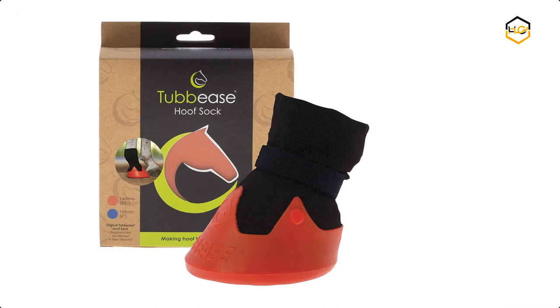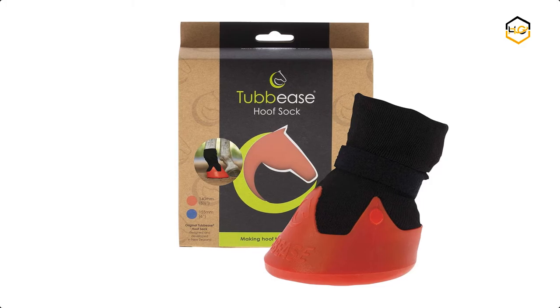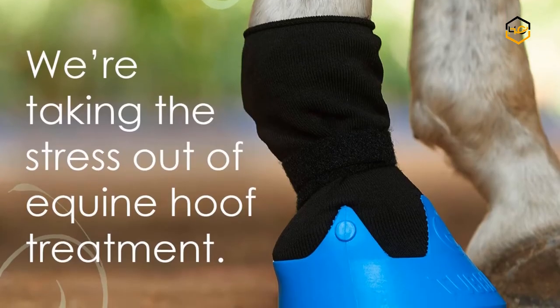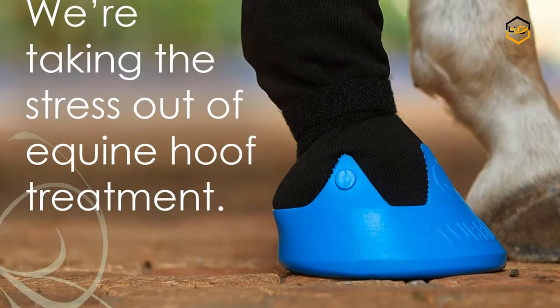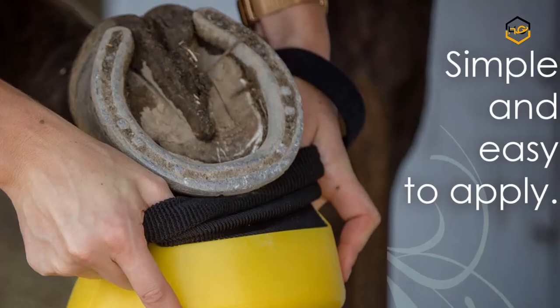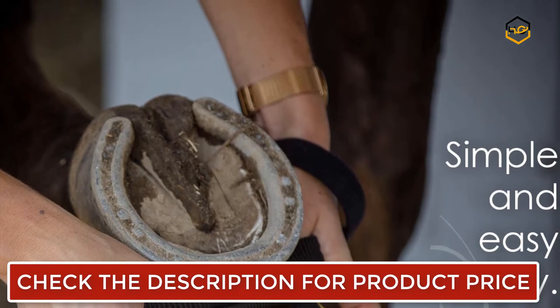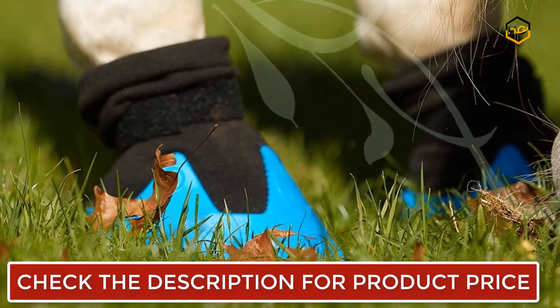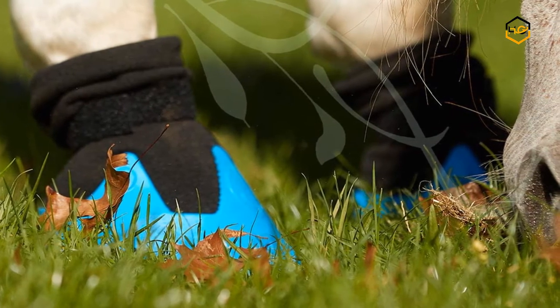At number 4, we have Tubby's Soaking Boot. Tubby's is the ultimate short-term equine treatment boot for a variety of hoof problems in horses and ponies. The PVC molded sock is perfect for hoof soaking, but can also be used over hoof wraps and dressings for wound protection and cleanliness. The EVA sole insert adds an additional layer of comfort for sensitive soles, and correct fitting is crucial to the success of Tubby's and the comfort of your horse or pony.